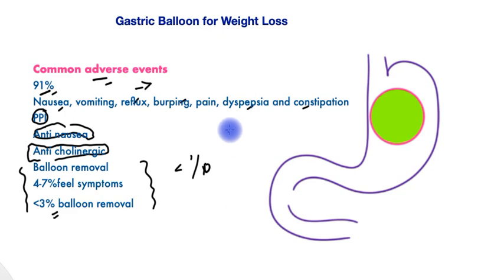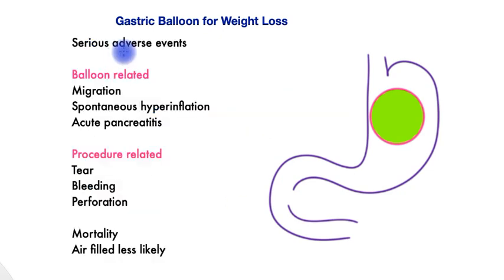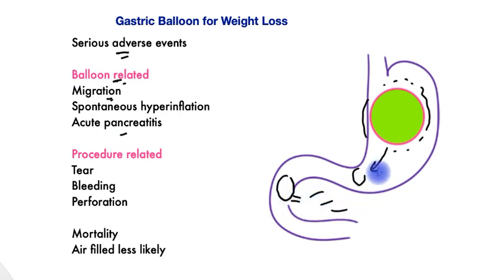For unethical practice, these complications can be much higher and more dangerous. Serious adverse events are very rare, but include those related to the balloon, such as migration. The balloon migrates away from its intended site and may cause obstruction at the outlet of the stomach, requiring the balloon to be removed. Rarely it can get bigger in size, giving rise to severe symptoms, or acute pancreatitis when the migration arrives at the outlet of the pancreatic duct, or rarely by direct pressure on the pancreas, which is behind the stomach.